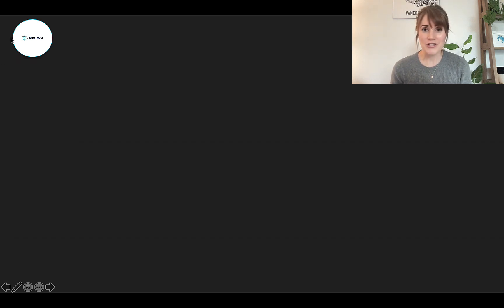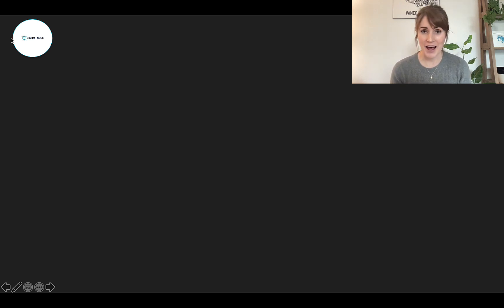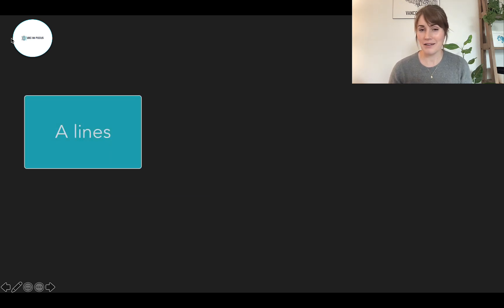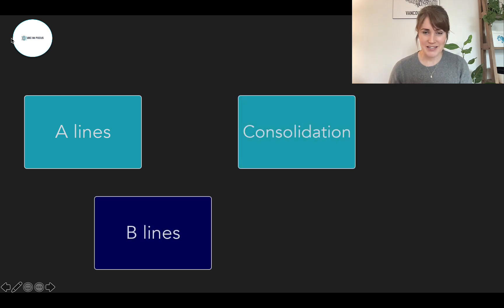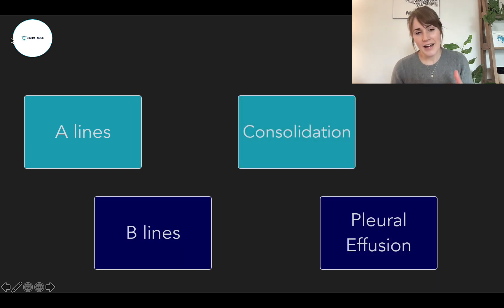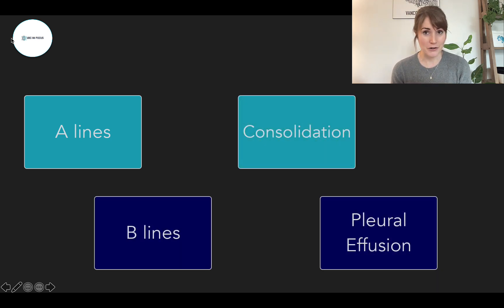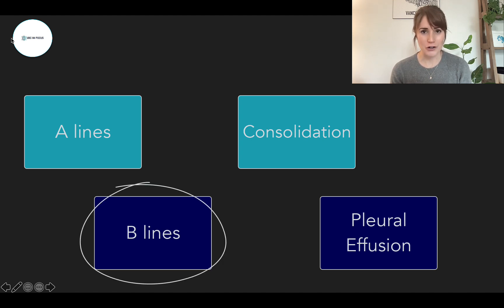As a reminder, some of the beauty of lung ultrasound is its simplicity. If you're doing it right, you should always be seeing one of four patterns: A-lines, B-lines, consolidations or hepatizations, and pleural effusions — and of course the pleura. We will talk a bit about the pleura today, but we're really going to zoom in on those vertical artifacts or B-lines.